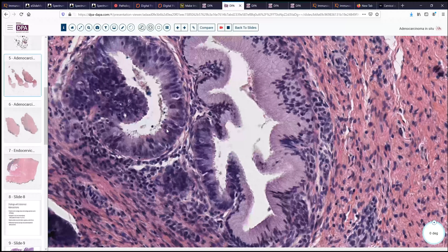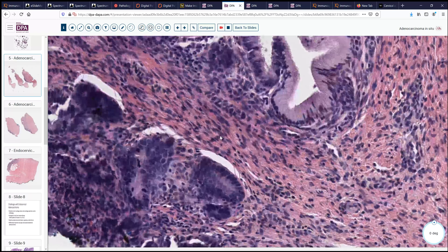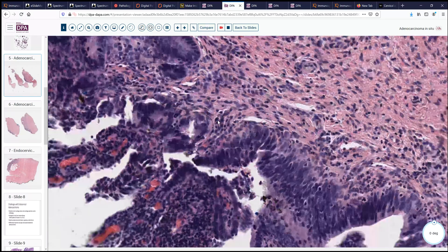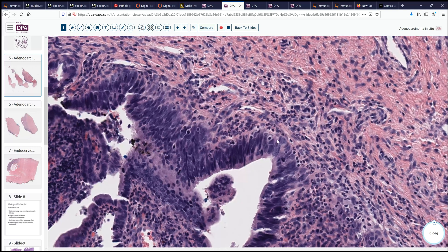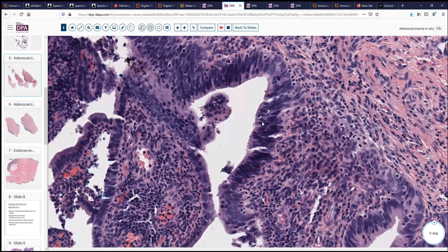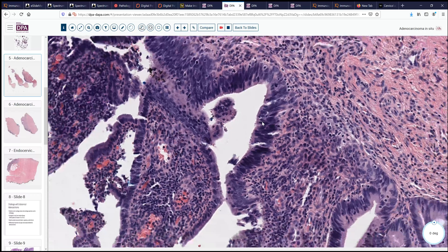Specifically, we can see that there's some mitotic activity, there's some karyorrhectic debris, and there's considerable stratification. Looking up more towards the surface, we can see more of this stratification, crowding of the nuclei, and more easily recognize these blue blobs of karyorrhectic debris and mitotic activity that characterize adenocarcinoma.